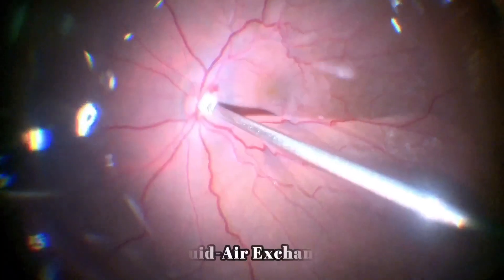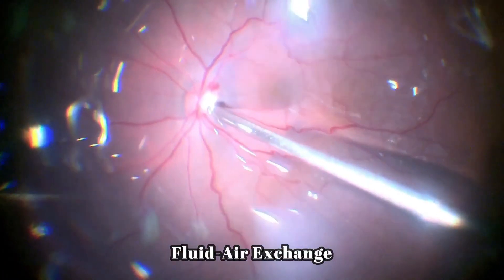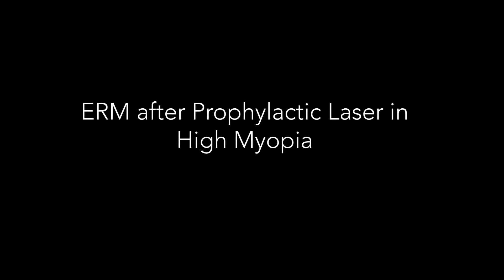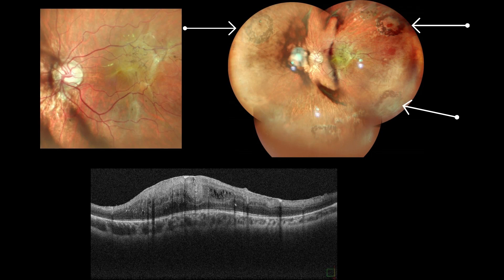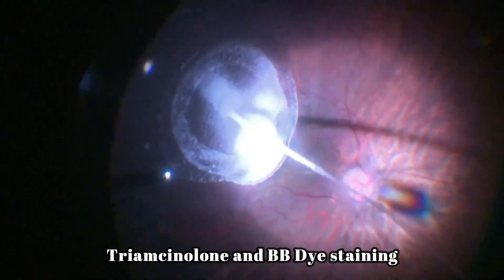After that, air-fluid exchange is done to finish the case. Next case is an ERM after prophylactic laser in a high myopic patient. Here you can see the laser done in the periphery, which was followed by formation of an epiretinal membrane.